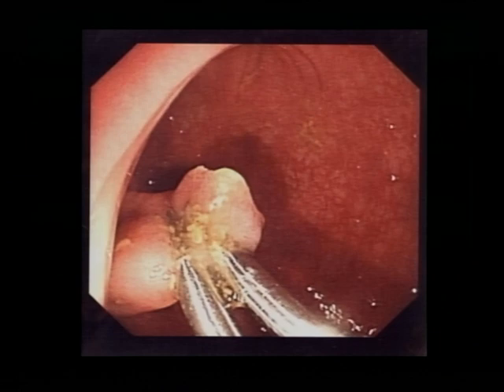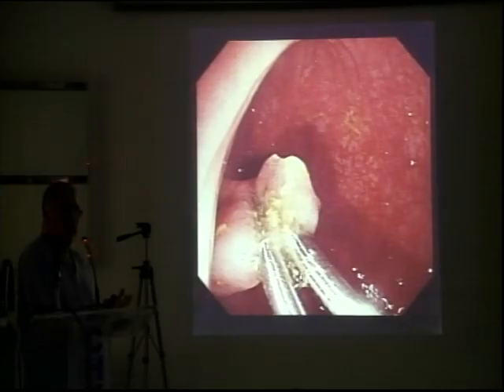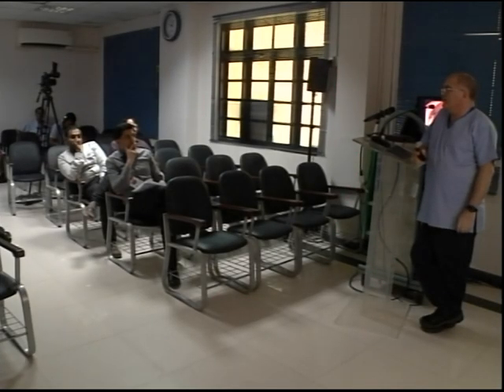So all these things you do in managing. So if you've not got access to actually stop the complication, then should you be doing it in the first place? Again, these are things you've got to actually think about when you're taking off polyps. And if I'm brutally honest about my own practice, the only times I've had issues is when it's been with the diminutive small polyps.